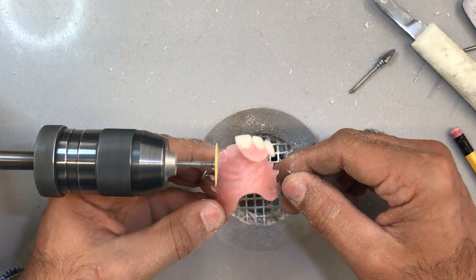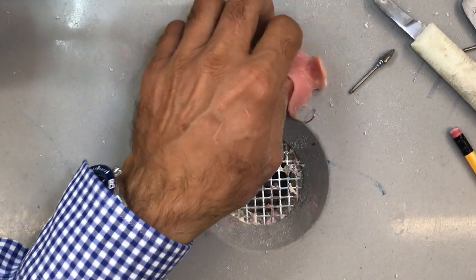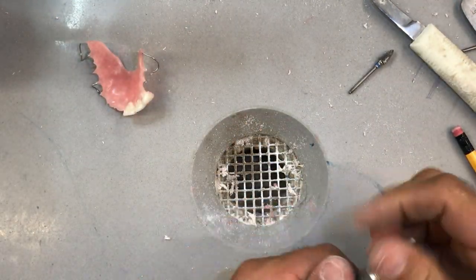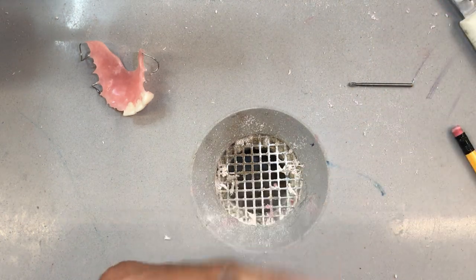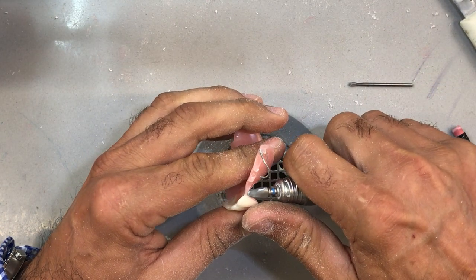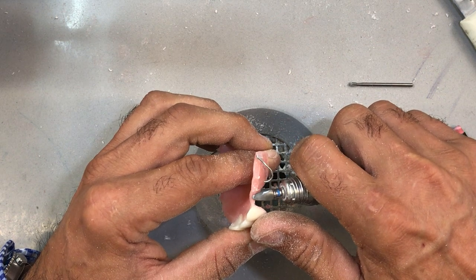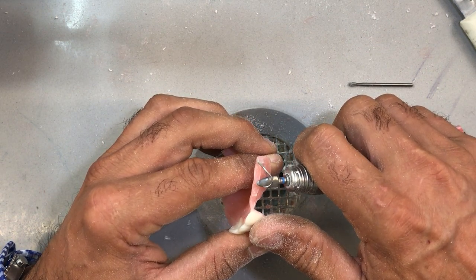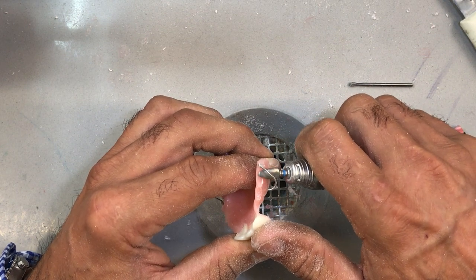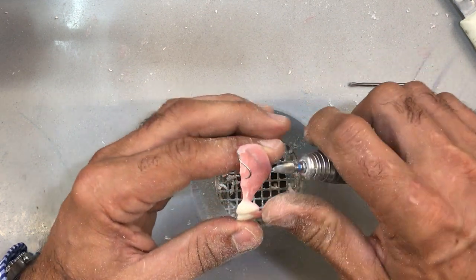Let's find a burr that'll fit here — probably around 25,000 RPM or so. This is not an easy thing: trying to find the right height of contour and eliminate just enough undesirable undercut in the acrylic base so we can fit it over our duplicate model. I've got to be really careful not to grind the mesial of that central so it meets the other central just right. There might be some undercut down here, so I'm going to reduce this flange just a little bit more and round off the inside ledge of that flange so it slides over the tissue a little bit easier.